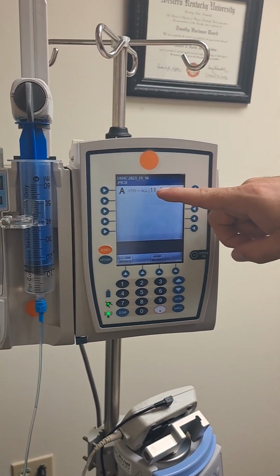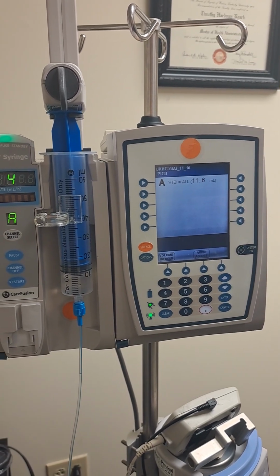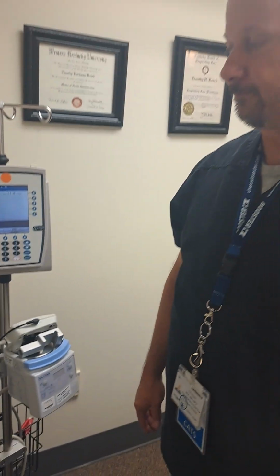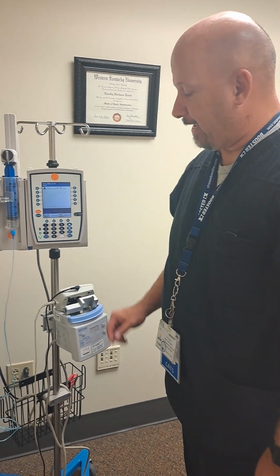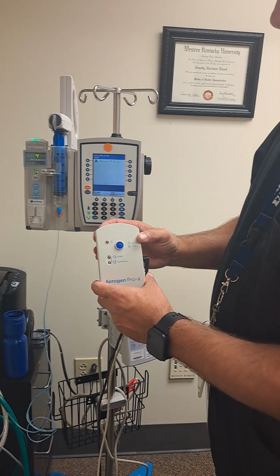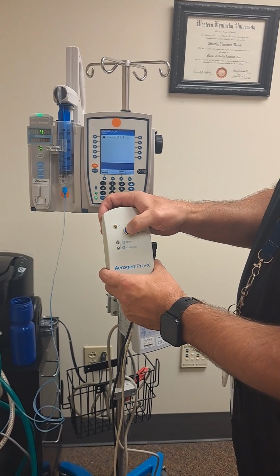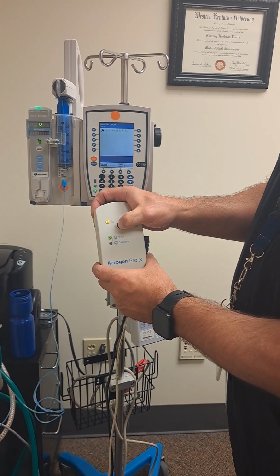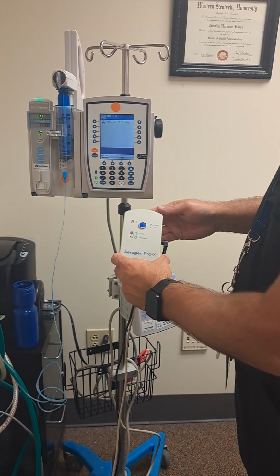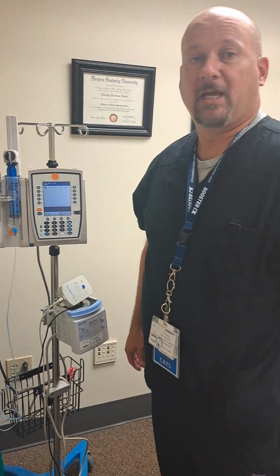It automatically calculated how much albuterol was left in the syringe. And so now it's going to give albuterol to make sure they get 20 milligrams of albuterol per hour. Then you will press the Aerogen generator. To get it to go to continuous, you press and hold it for 3 seconds until the light beside continuous comes on. And now your continuous albuterol treatment has started, and it will run continuous until you stop it.